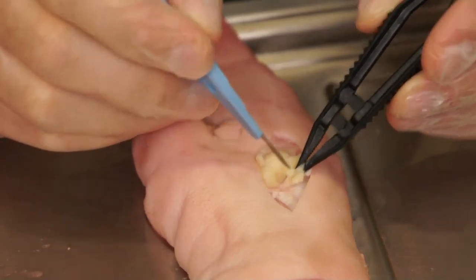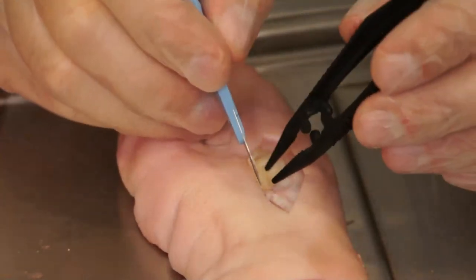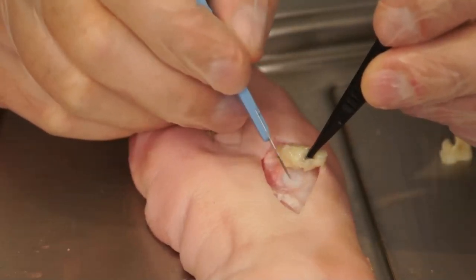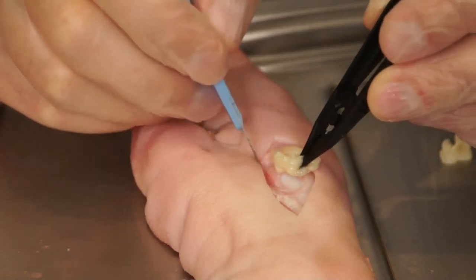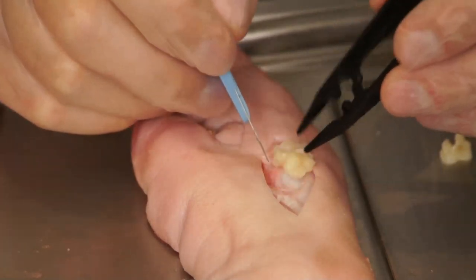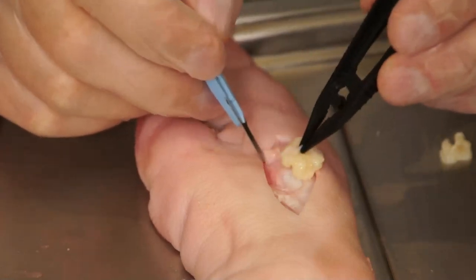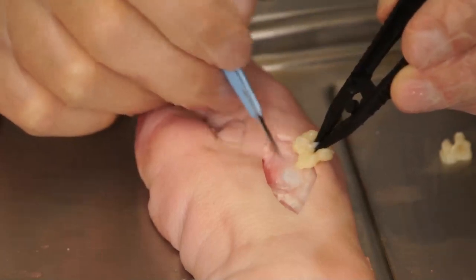With a dermal curette, oftentimes the blade will fill with the necrotic tissue being removed and will necessitate more than one instrument. In this demonstration the scalpel and forcep instrumentation is being used to remove the yellow necrosis. Short even strokes are applied with minimal pressure being directed into the base of the wound, which will prevent injury to underlying structures as well as minimize any bleeding that may occur.